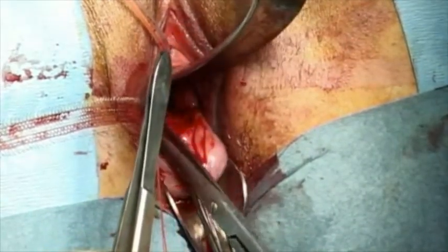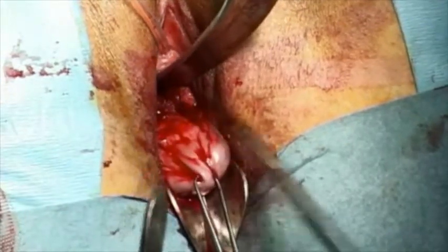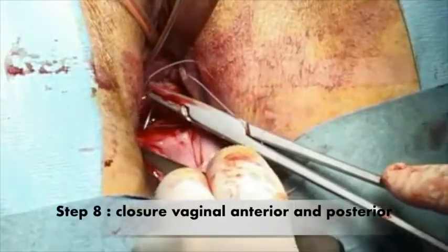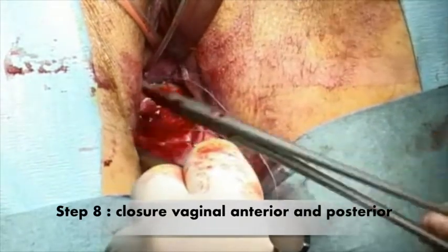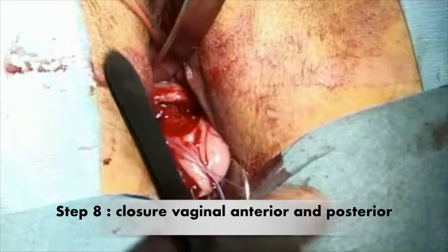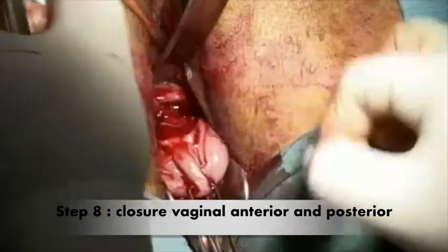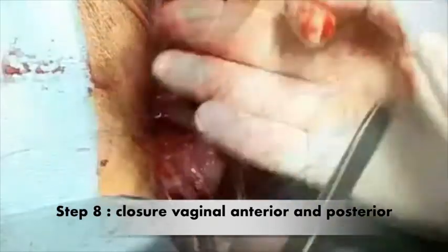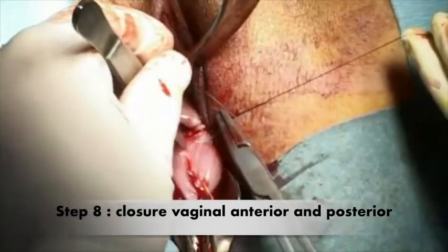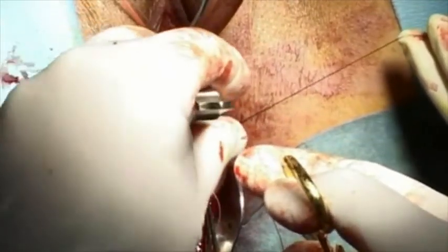The positioning of the sling is now over. The anterior and posterior vagina must be sutured. On the anterior vagina, a continuous suture is performed using absorbable suture 0. This continuous suture is designed to be hemostatic on the pericervical incision zones. The same technique is identical on the posterior vagina.